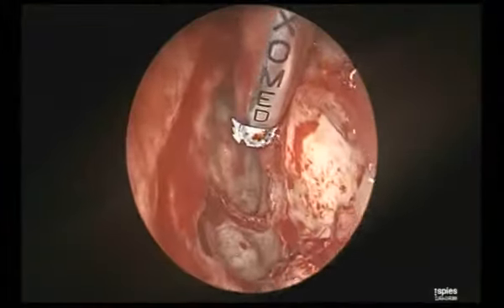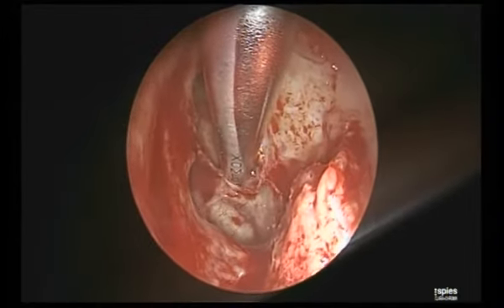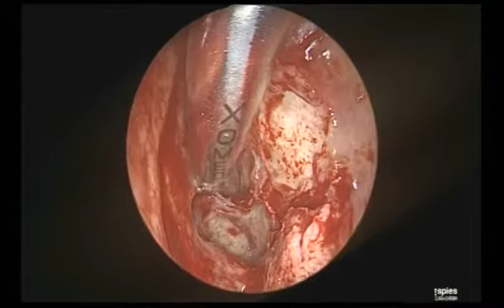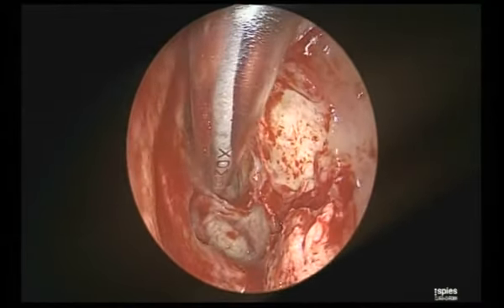Anything on the skull base at this level. See, with the 70, my rear facing blade becomes the front facing. Can you see? My cutting edges are in view. You can't do this with your regular blades at this angle. See, beautiful. That's the advantage of the reverse blade, the adenoid blade.